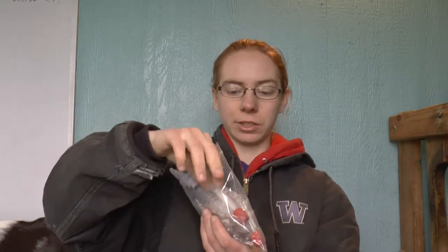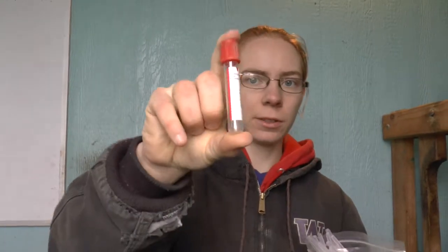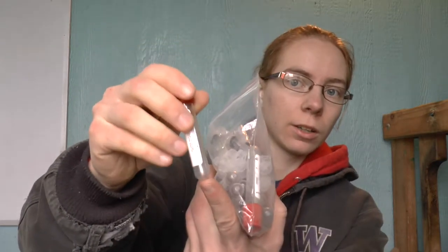I have a whole bag of these here because we're doing 13 goats today. You'll also need blood tubes — you draw the blood with the syringe and then put it in the blood tube to bring or send to the lab. These are 4ml red top tubes. CAE is really simple — you don't really need a special tube. Red top is the empty kind; some different tubes have different things in the bottom to prevent blood from clotting while it's being shipped. That doesn't matter for CAE — you just use a red top tube. The 4ml is the smallest, so that's what we get to put our 3ml of blood in. They are vacuum tubes, but if you have them for very long, they lose their vacuum — which is fine, you just use the syringe and push the blood into it.